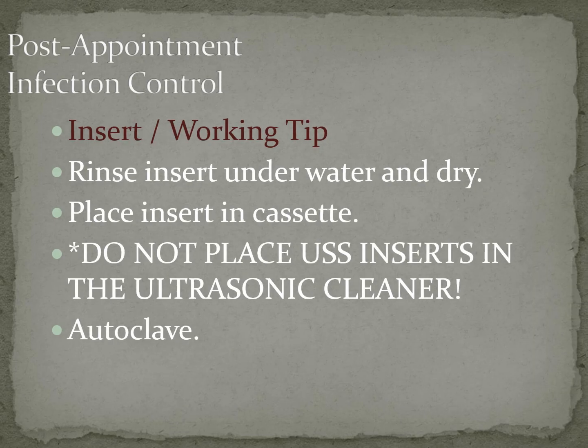Okay, post-appointment infection control. Rinse the insert under water and dry it, and you're going to place it in your cassette. We don't ever put these in the ultrasonic cleaner, okay? The ultrasonic cleaner is going to be really hard on your magnetostrictive strips. So never, ever, ever put those in the ultrasonic cleaner. Okay, then you're going to autoclave those tips. We always need to make sure that our lines are dry. So make sure that you remove all the water from your ultrasonic lines, just like you remove the water from your air water syringe at the end of an appointment. Okay, we don't want those biofilms being created in our lines.